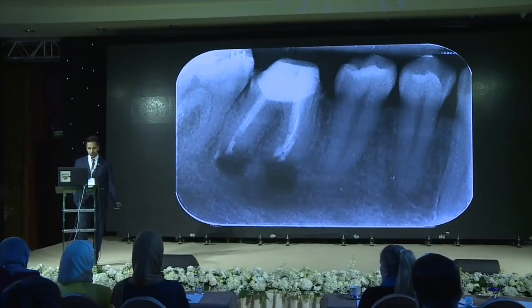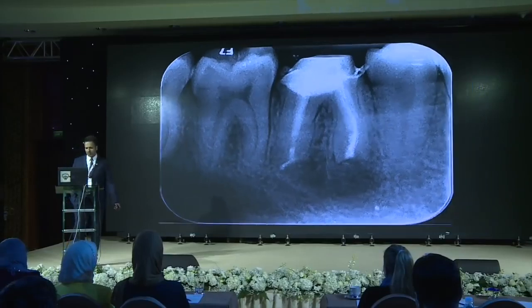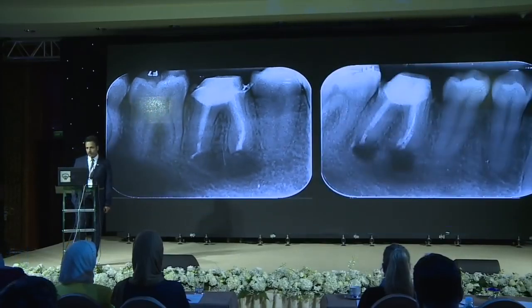So we did the procedure, and then I talked to him after 1 week, and he said, listen, the pain is gone. So I took another radiograph 4 months later, and you can trace the PDL around the mesial root. Not sure about the distal root. But there is a complete bone fill.